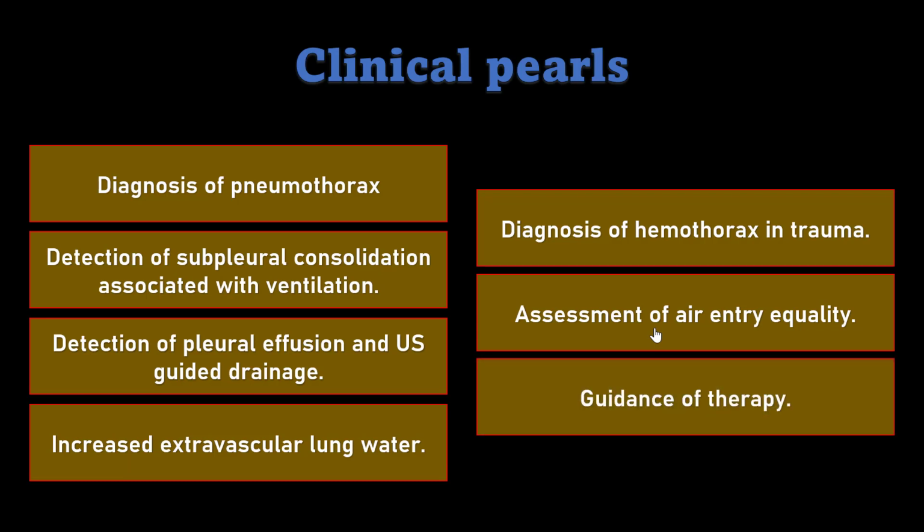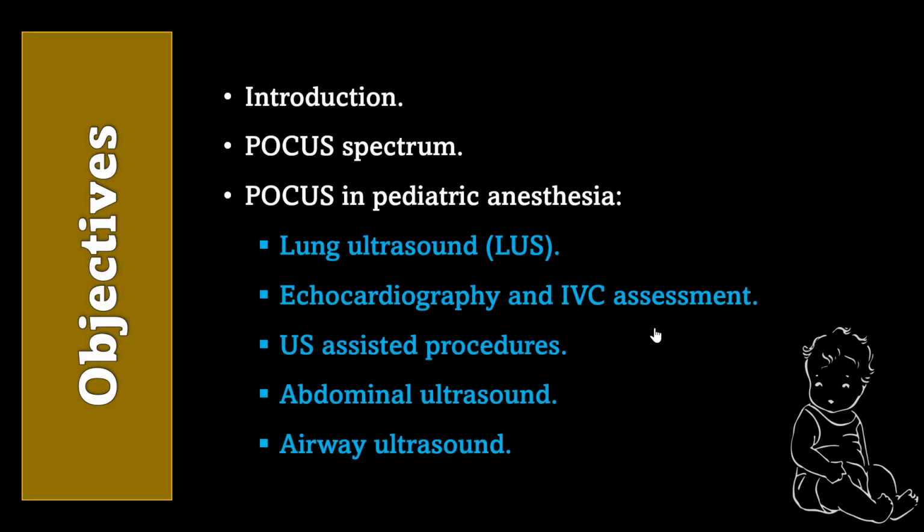Guidance of therapy. If you detected an abnormality in the lung and you started an intervention, you can follow up with lung ultrasound in a bedside way.